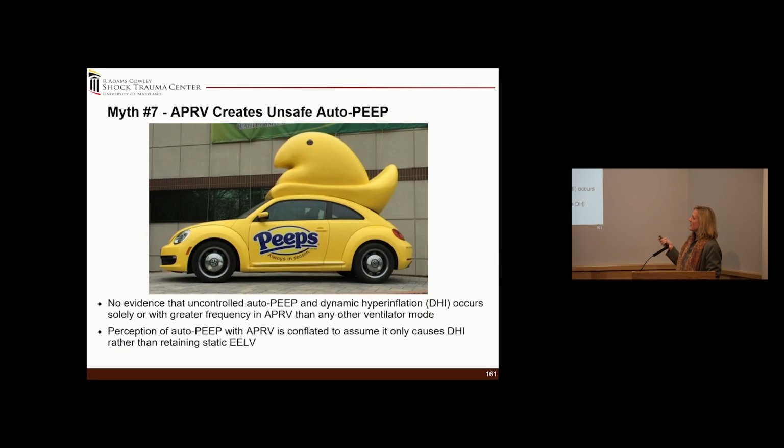APRV creates unsafe auto-PEEP. There is no evidence that auto-PEEP and dynamic hyperinflation occur solely or with greater frequency in APRV than any other mode of ventilation, and the perception of auto-PEEP with APRV is conflated to assume that it only causes dynamic hyperinflation rather than a static end expiratory lung volume.